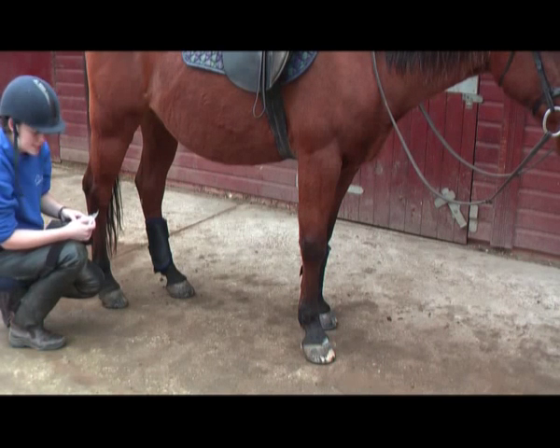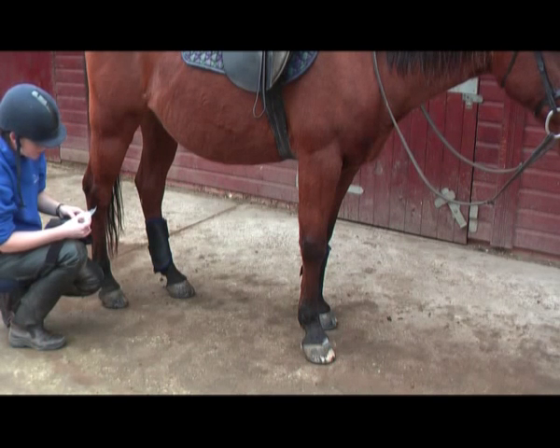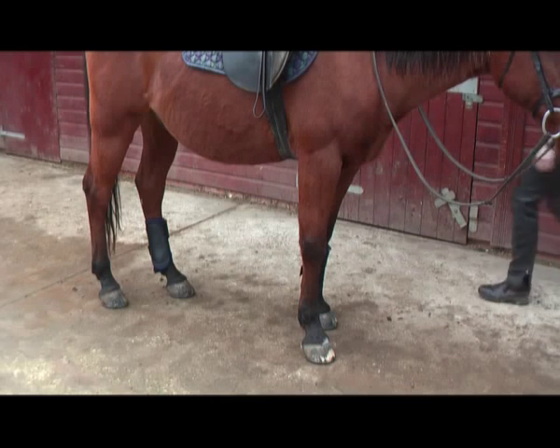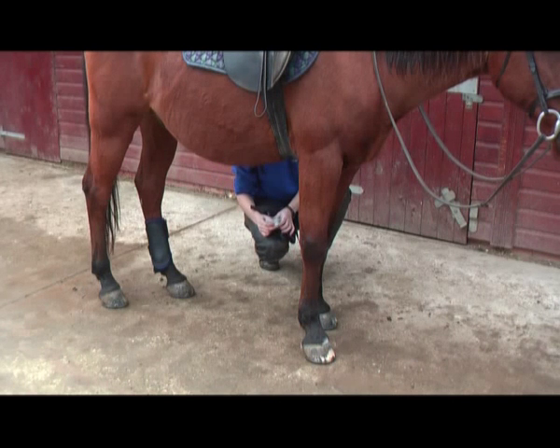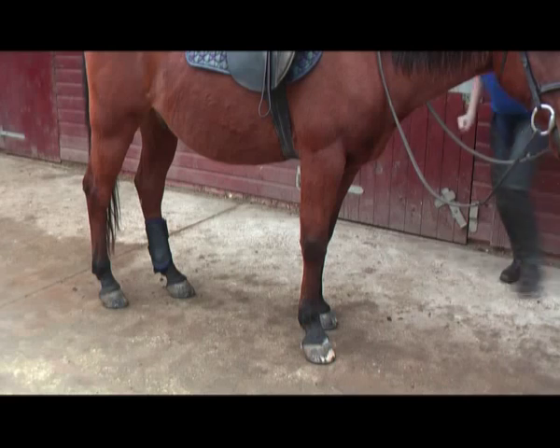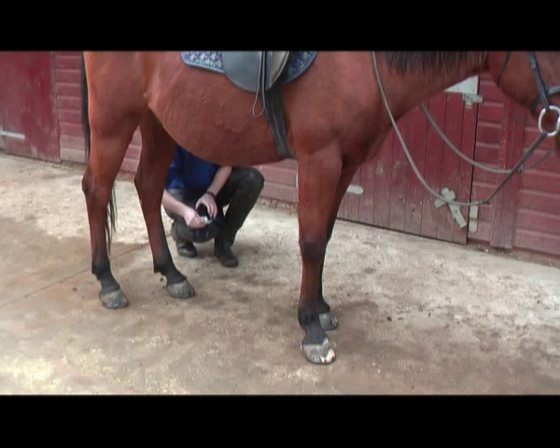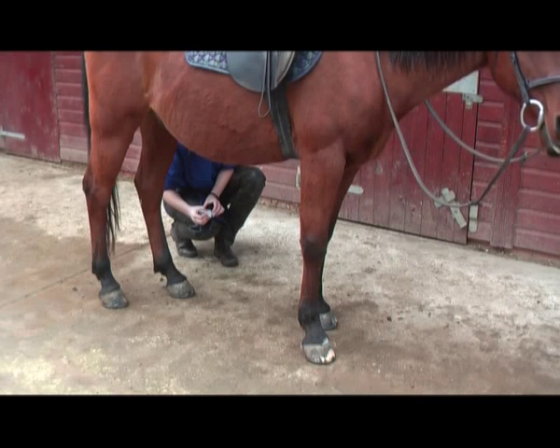I see that my sensor still has its green flashing light, which is great. I can now switch it off with the small black button. This sensor also still has a green flashing light, so I can switch this off with the small black button. This sensor also still has a green flashing light, so I press it off with the small black button.